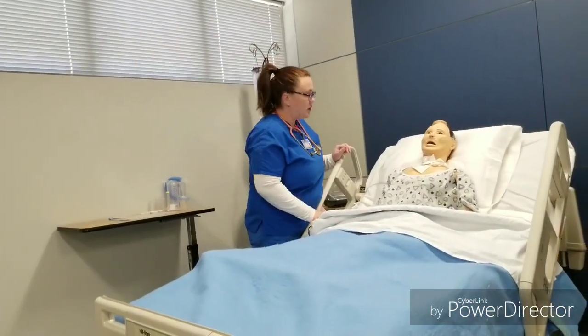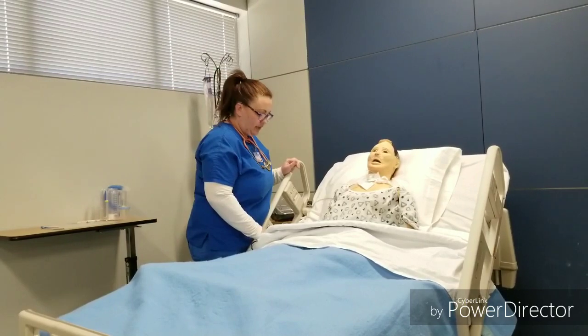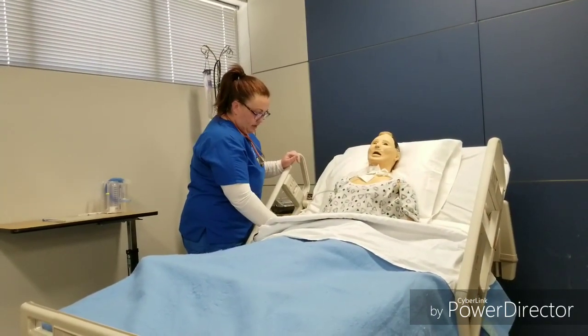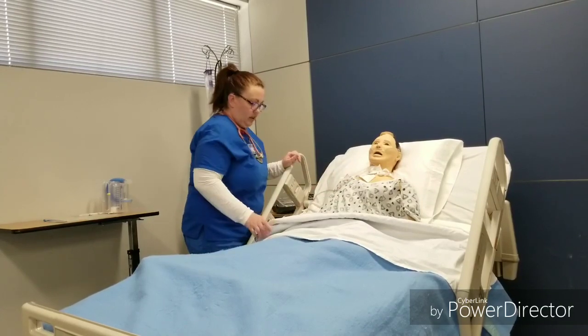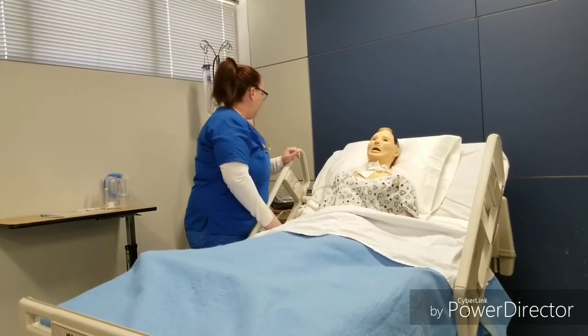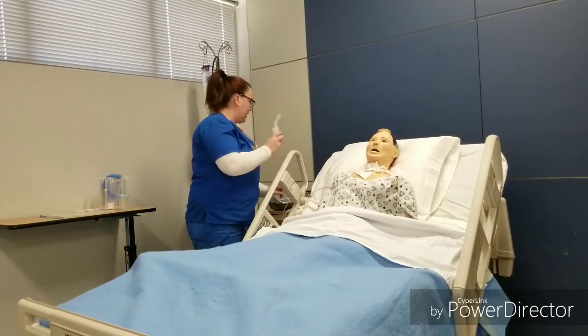Hello, Mr. Smith. Could you tell me your name and date of birth, please? All right, thank you. Check the wristband. All right, I have your nebulizer treatment, and I'm going to help you with that today.